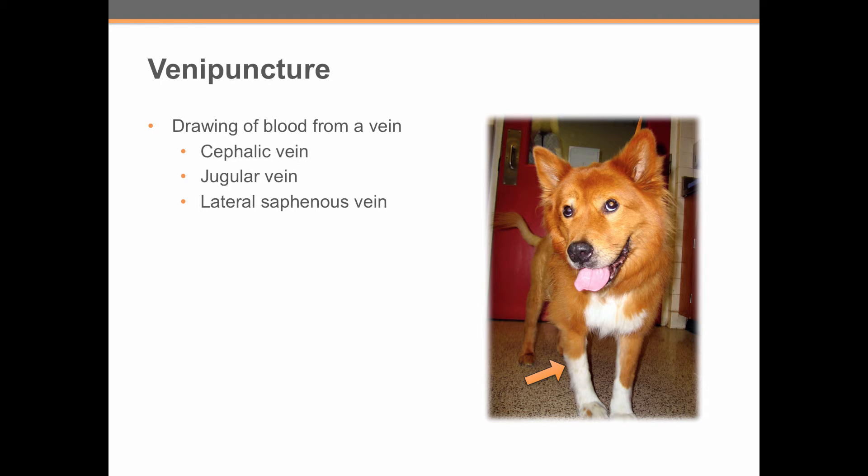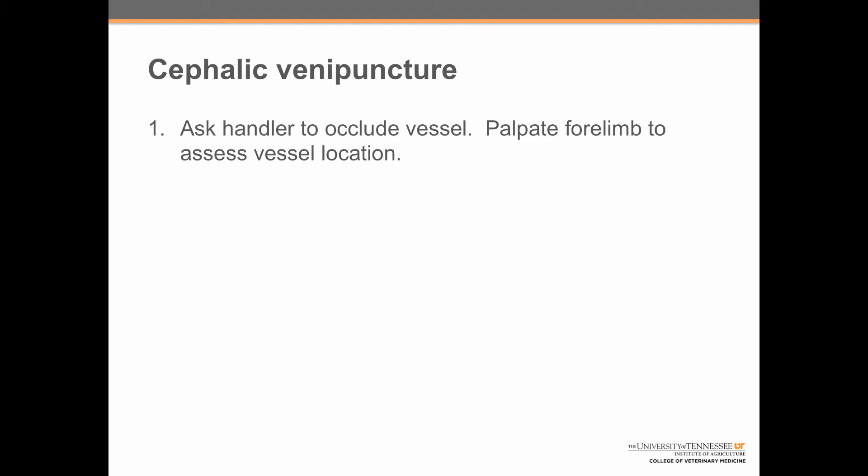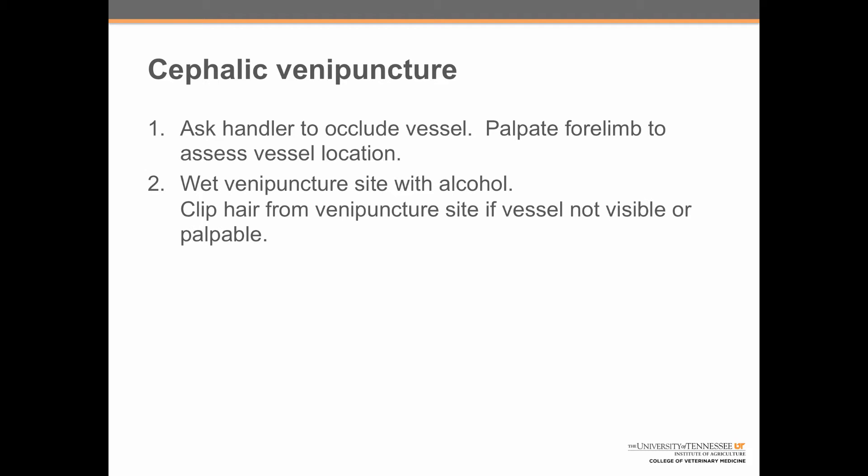In this video, we're going to review drawing blood from the cephalic vein. There are nine steps to performing cephalic venipuncture. The first step is to ask the handler to occlude the vessel and then palpate the limb to assess the vessel location. Step two is to wet the venipuncture site with alcohol.